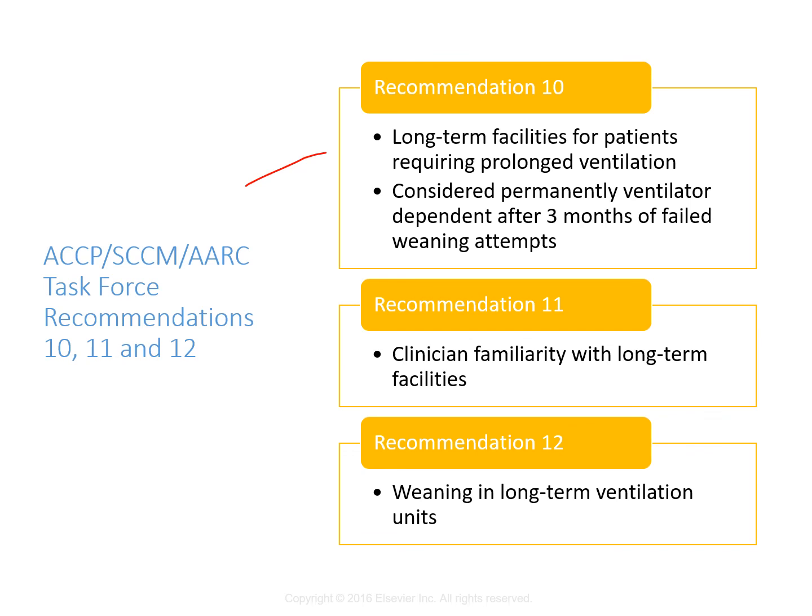The big thing here is to progressively reduce the ventilator support, reduce the invasiveness of the support, so more independence, preserve or improve their current function, and then maintain their stability. So it's a long-term game with their weaning procedures, and it works, right? They're usually individually designed and not just a fixed protocol.